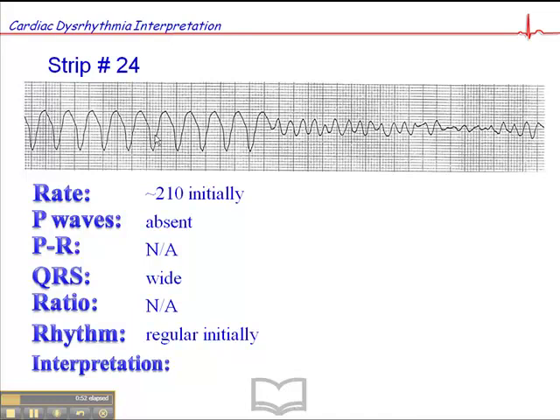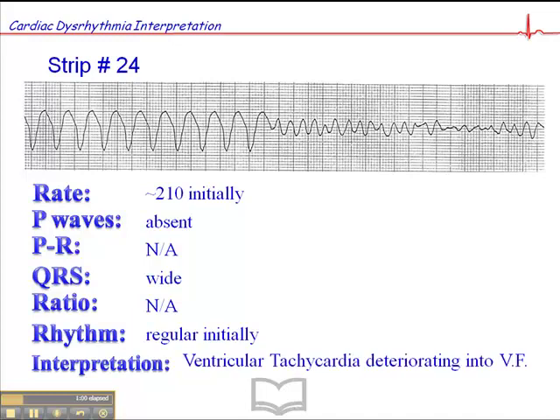That fits the criteria for ventricular tachycardia. And then it deteriorates into this completely disorganized rhythm — that quite simply is a ventricular tachycardia deteriorating into ventricular fibrillation.